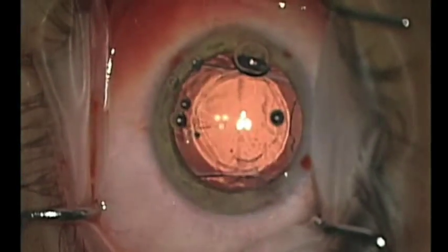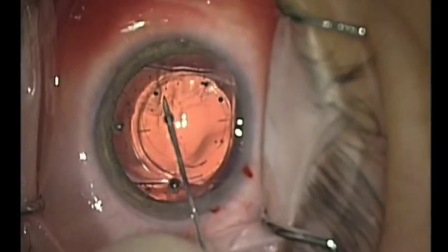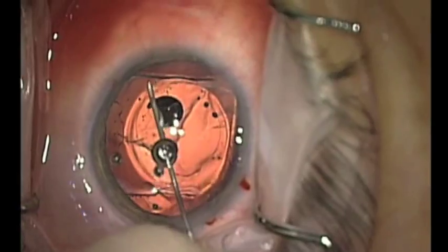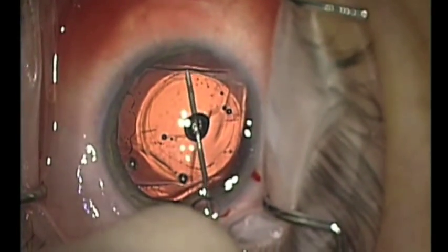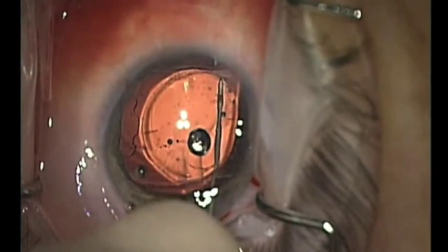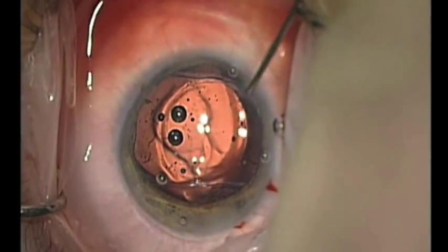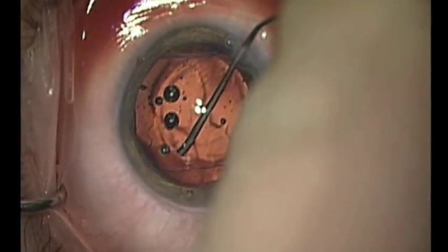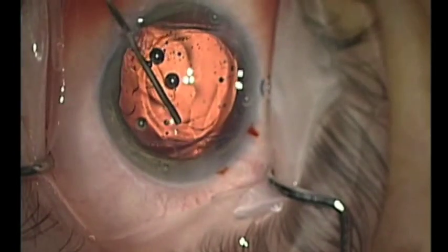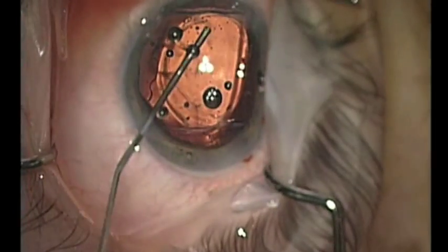The 30 gauge cannula is unable to separate the lens from the anterior capsule, but rather a 27 gauge needle on a dispersive viscoelastic is used to visco-dissect the anterior capsule away from the intraocular lens in various locations. Once the potential space has been created, a blunt cannula can be used to inject more dispersive viscoelastic in various locations to ensure that the lens is mobile beneath the fibrosed anterior capsule.